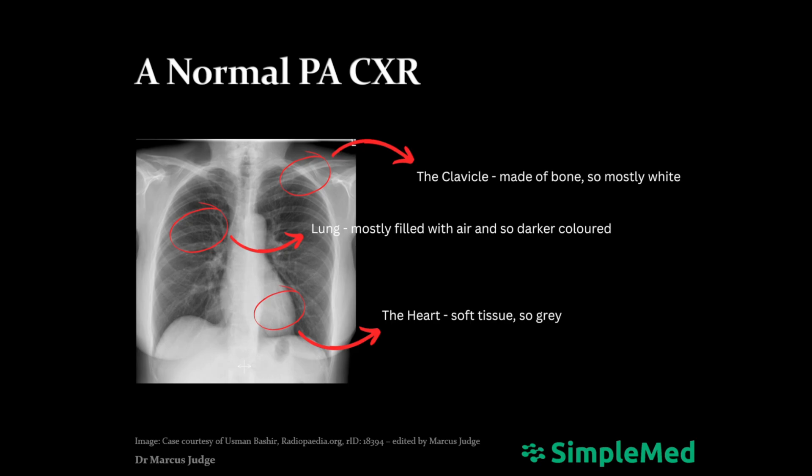The clavicle, made of bone, appears mostly white. The heart, made of tissue, is quite thick and so despite the tissue being less radiologically dense, it also appears quite grey-white. The lung area, which is mostly filled with air, appears darker. Note the presence of white streaks across the lungs — these are lung markings from the lung tissue and are entirely normal.